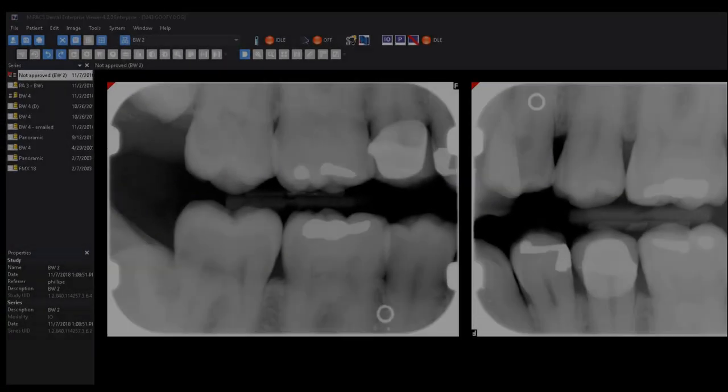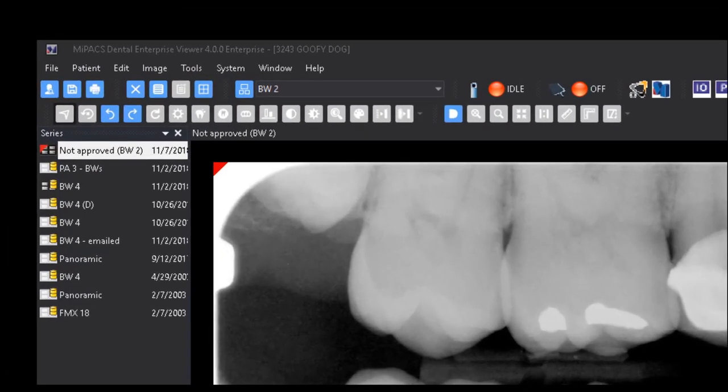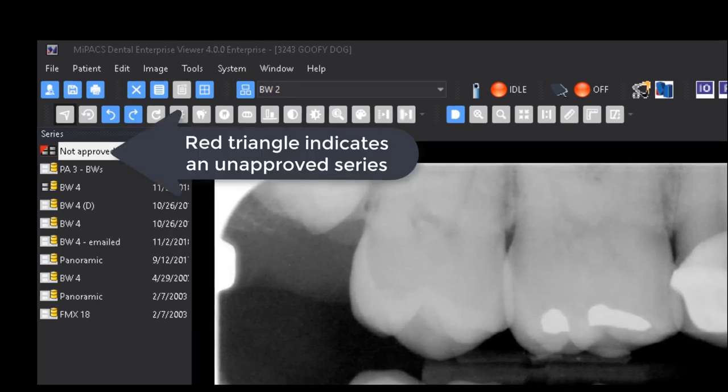The series view is a list of available image studies on the left side of the viewer screen. Each series is represented by an icon indicating a different state.